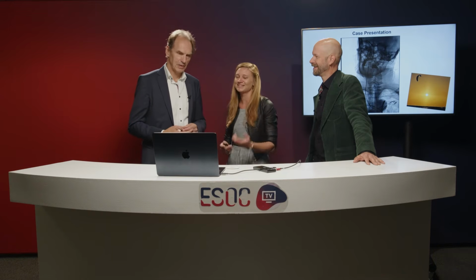That I wanted to say, that's the second thing you can do. In this case, it was not necessary to inflate it so much that it stuck in the vessel. This is the second thing we do if we have success with that. Then we use it as an anchor, so that we have the pressure to get the other devices up. So here you let it flow, like the kite flies in the wind.